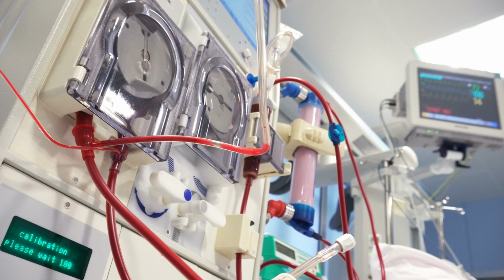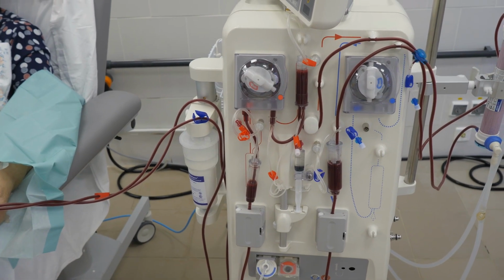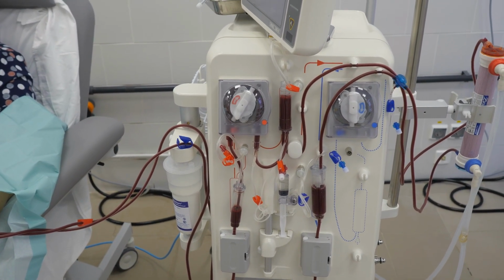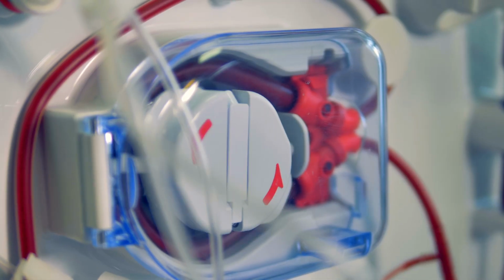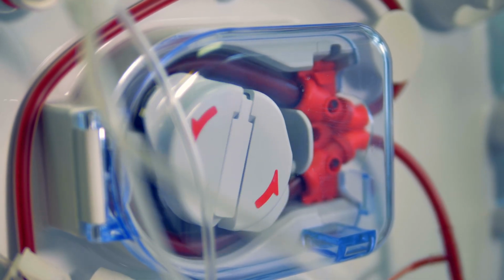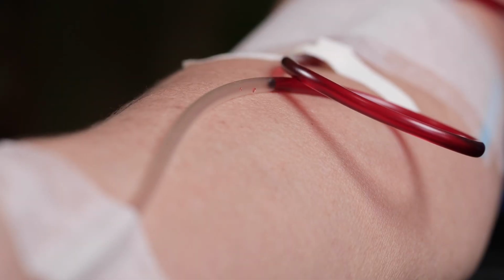On average, a hemodialysis patient can be exposed to 300 to 600 liters of water per week. This puts them at a high risk for exposure to waterborne pathogens. Repetitive exposure to chemicals or microbiological agents that are present in hemodialysis fluids can cause serious harm to patients, like bacterial or fungal infections, chemical intoxication, hepatitis, and gram-negative bloodstream infections.